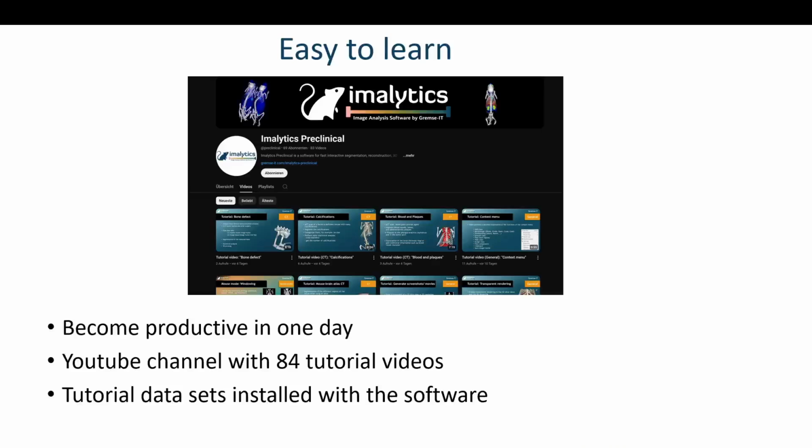Our software is easy to learn. You can become productive in one day, and we have a YouTube channel with 84 tutorial videos, and the tutorial datasets are also installed with the software.